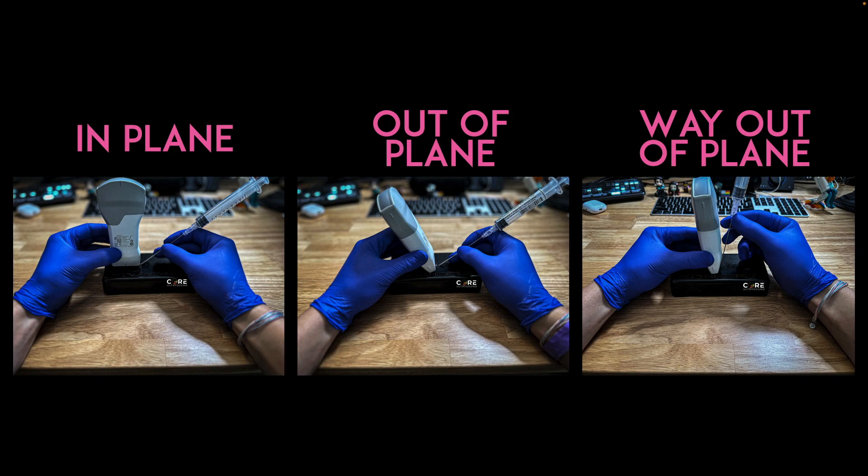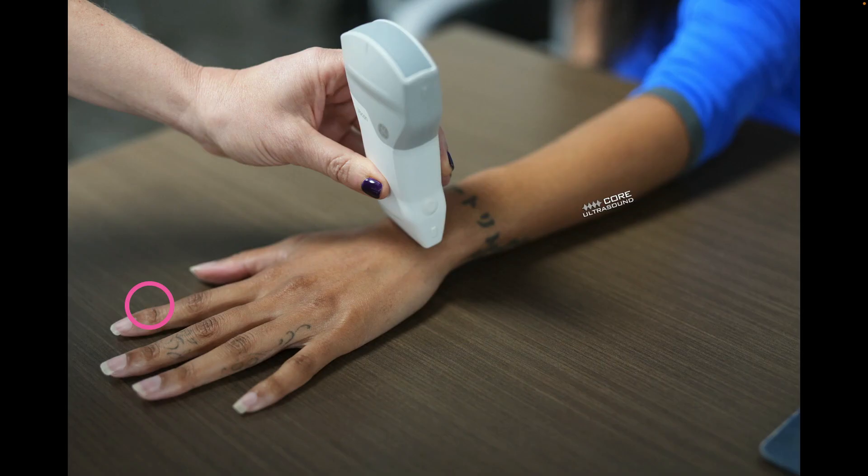With regards to aspiration or injection, we can do this under three different techniques: in-plane, out-of-plane, or way out-of-plane. With these smaller joints, I'm honestly often going to go with an out-of-plane or way out-of-plane approach, but you definitely can do an in-plane approach as well.